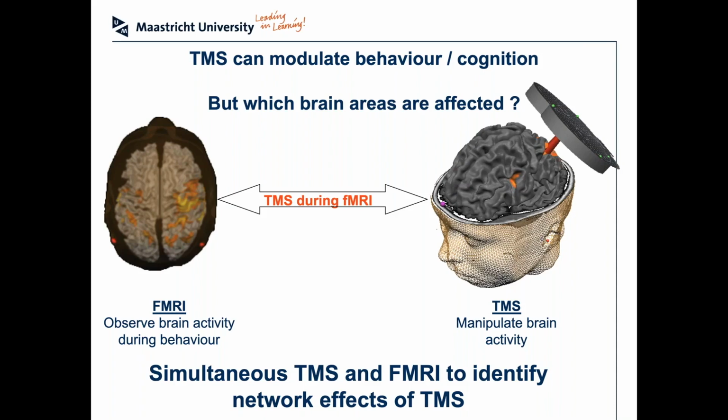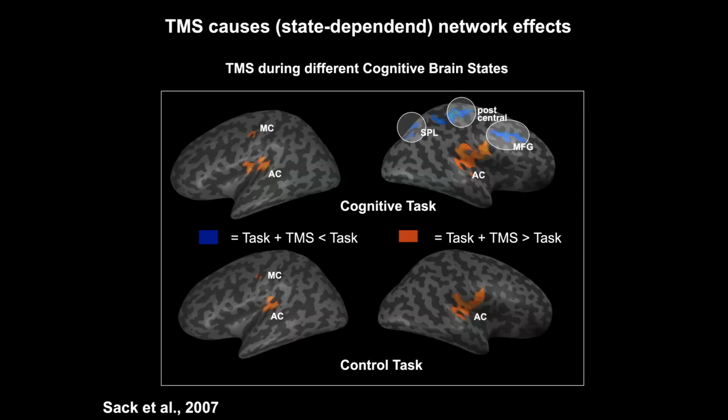And this is technically a more complicated setup, but still for a long time already, this is technically possible. And there are MR-compatible TMS systems available. And a couple of groups have done a lot of research on this, including our own group.